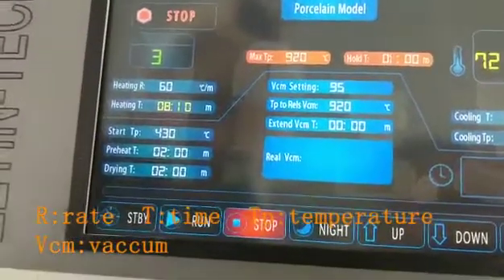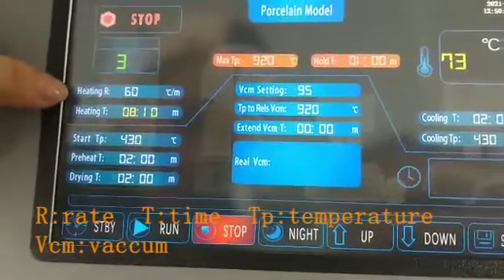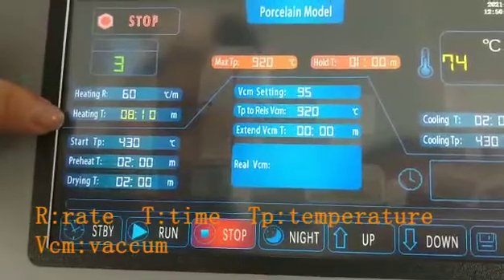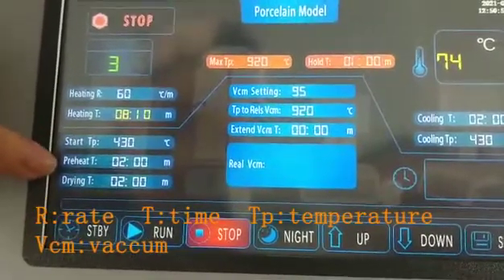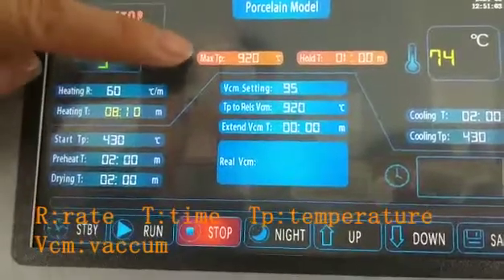Here is the meaning of the parameters. The first one is heating rate, and the second one is heating time. Then start temperature, preheat time, drying time, and this one is the maximum temperature.